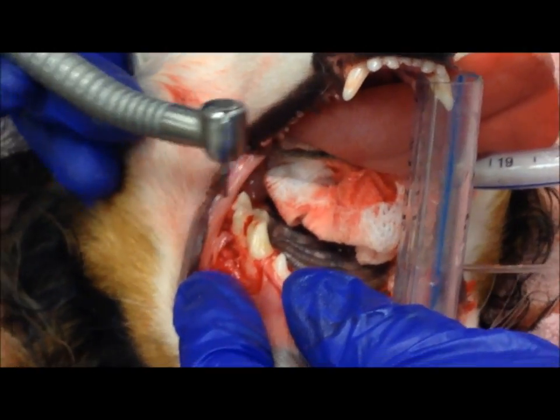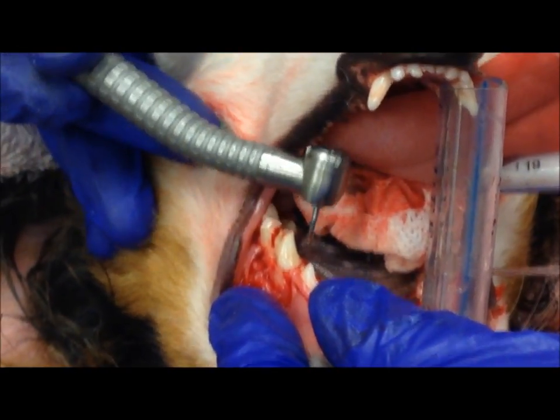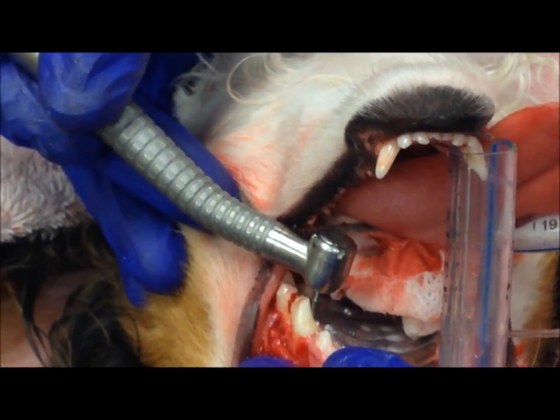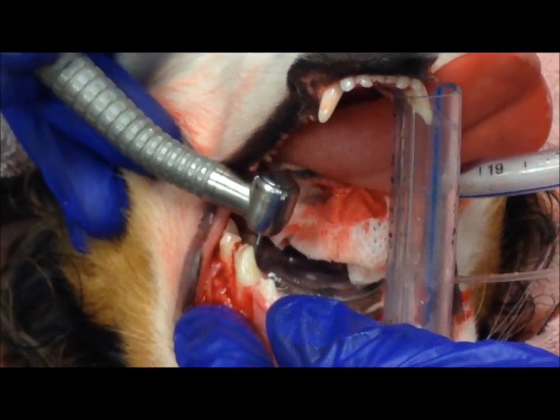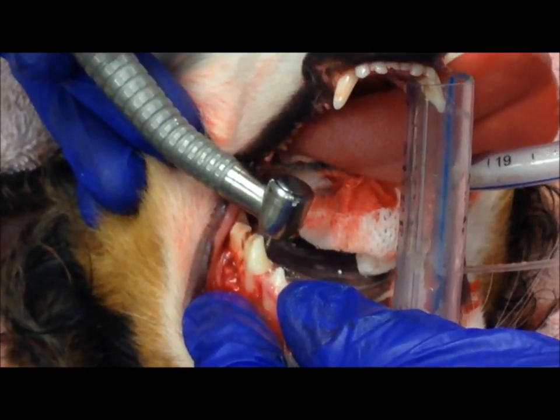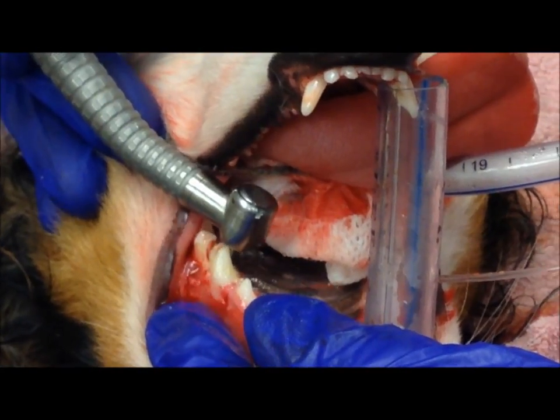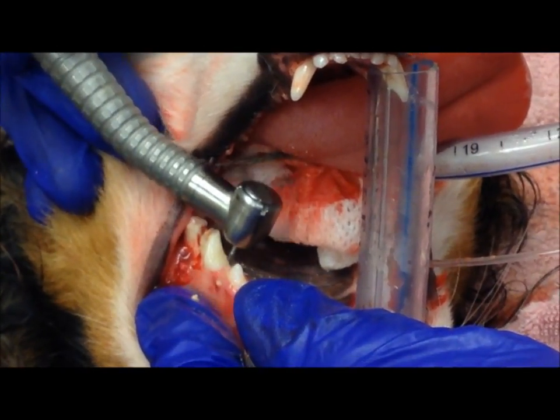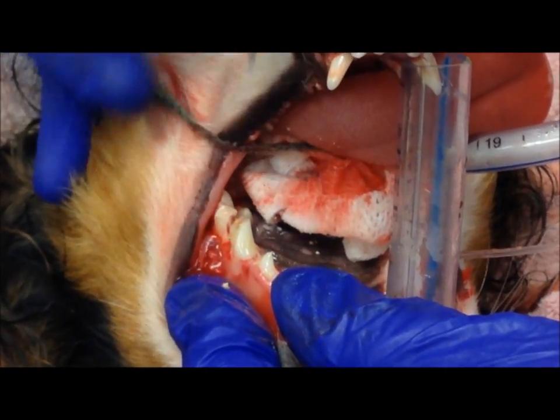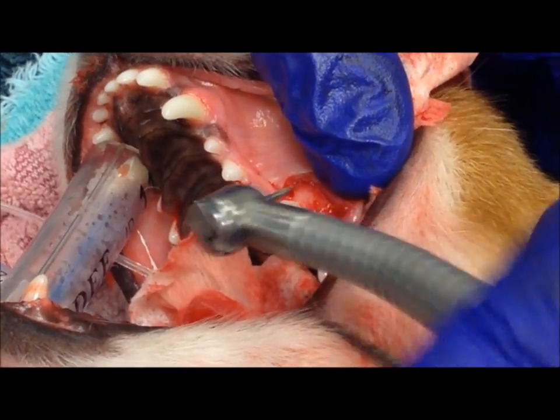Next I'm going to separate the two front roots, or mesial roots. There's a root right here and there's a root right here. Now I'm going to remove some of the overlying bone here to make it easier to remove the root from its socket.